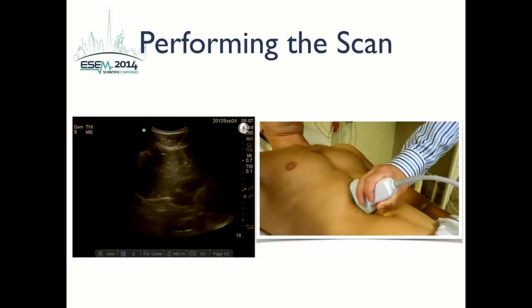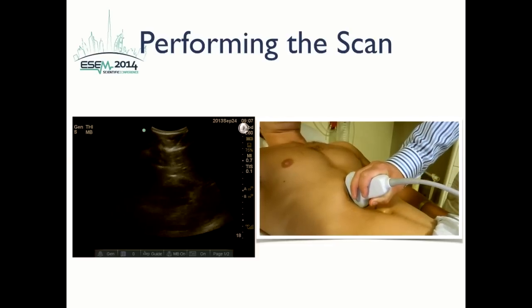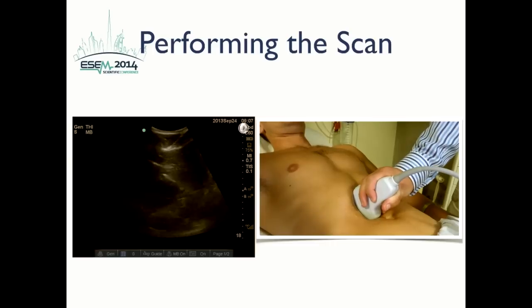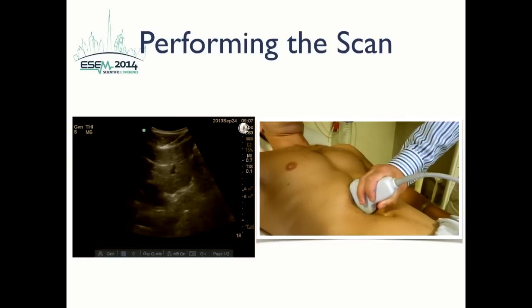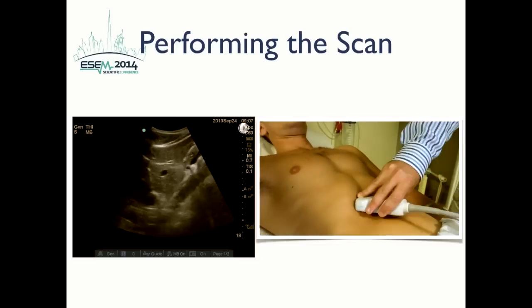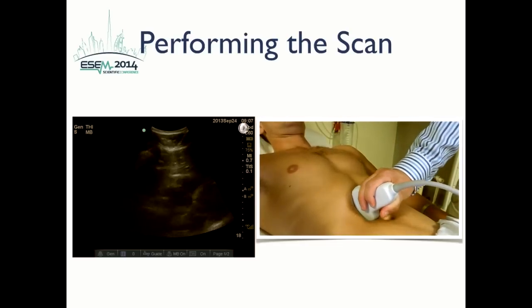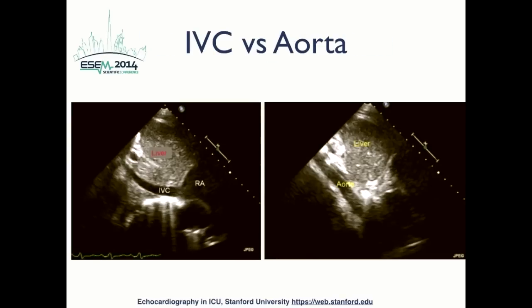Once an appropriate sub-xiphoid view of the heart is obtained, the probe is rotated 90 degrees until the marker is pointing towards the patient's head. At this point, the IVC should be visualized in a longitudinal plane as it enters the right atrium. The IVC going through the liver merging with the right atrium can be distinguished from the abdominal aorta by following the vessel — the most important part is to visualize the IVC entering the right atrium, which is the only way to distinguish it from the aorta.